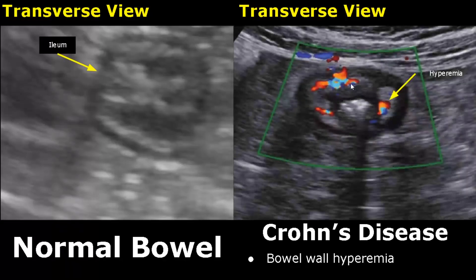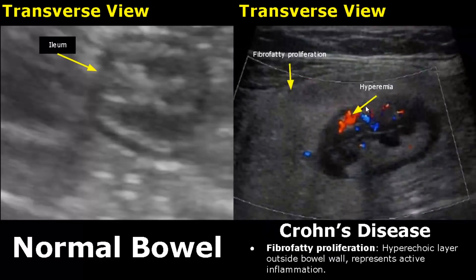On color Doppler, excess blood flow or hyperemia is found in the bowel walls. Normally, no flow will be seen in the bowel walls on color Doppler. In this image, we can see fibro-fatty proliferation, which appears as a hyperechoic layer outside the bowel wall — this is due to inflammation.